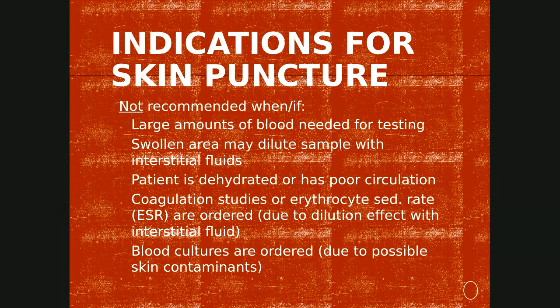If a patient is dehydrated, they're going to be less likely to produce a blood drop. The other thing too, if they have poor peripheral circulation near the surface of the body, this could also cause us not to get enough quantities. So this would be another indication of when it is not recommended to do a skin puncture.